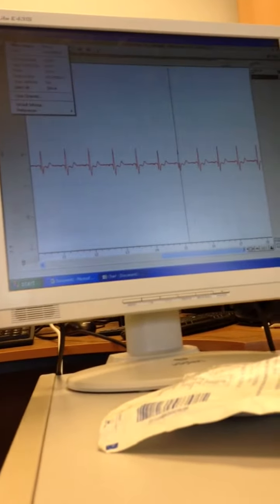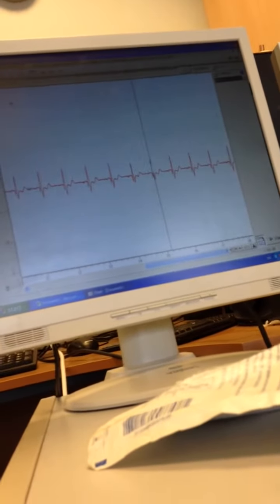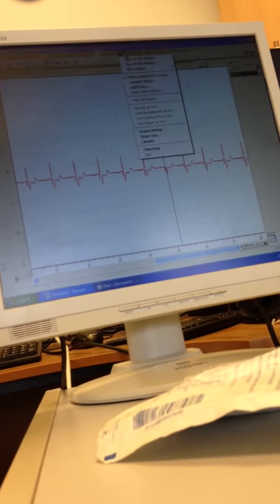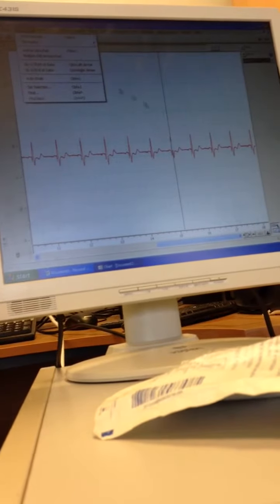Is it append in the note? I basically just put in a note. Is it not one of the buttons? Can you right click? Yeah, you might be able to right click, that's true. Comment options? Is it? Ah, set marker. Oh, there we go.